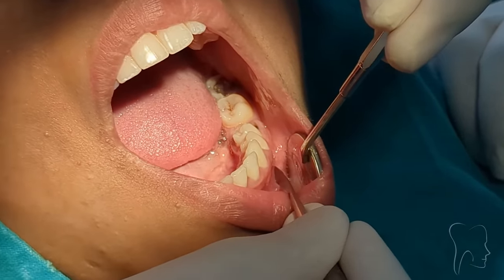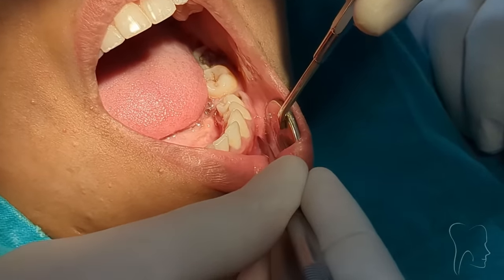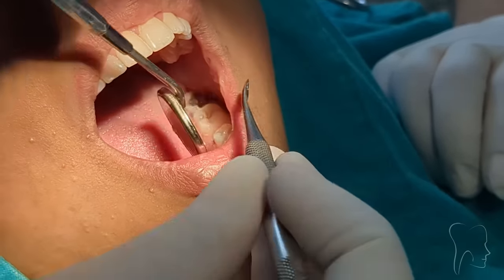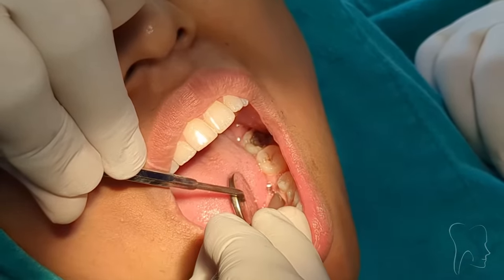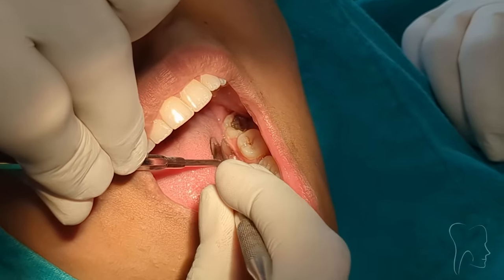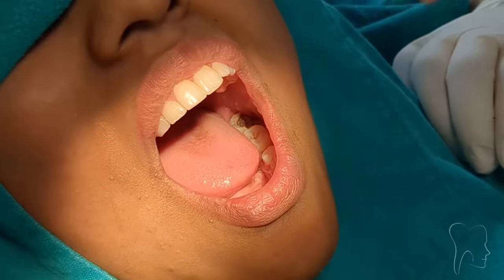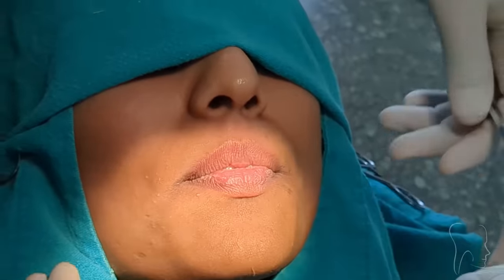Do you feel any pain? The inferior alveolar nerve block has acted fine, and the long buccal has acted fine. Now I am going to check for the lingual. Is there pain here? No? So can you compare right and left side — there was pain here but there is no pain here? Yes.